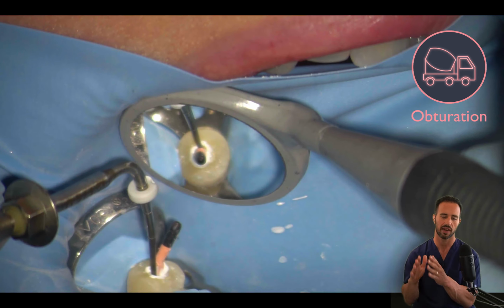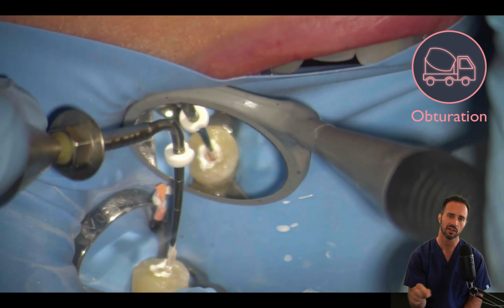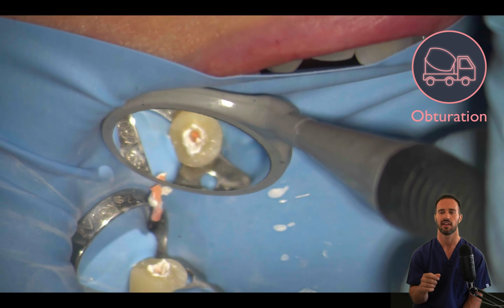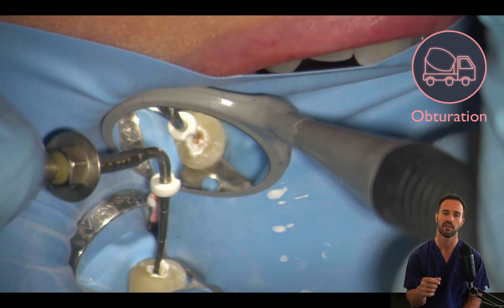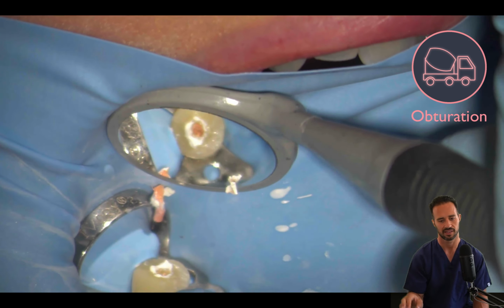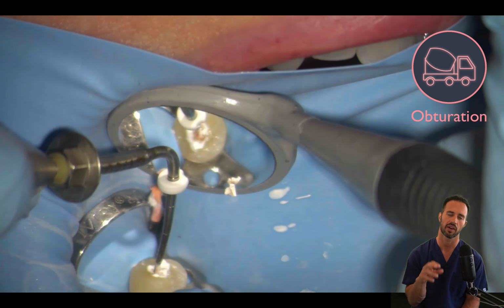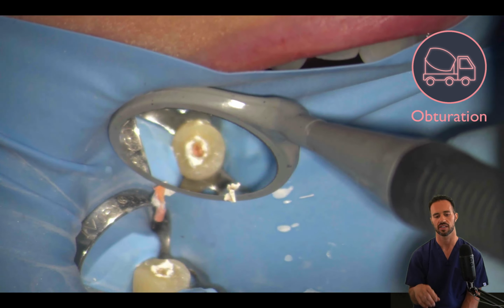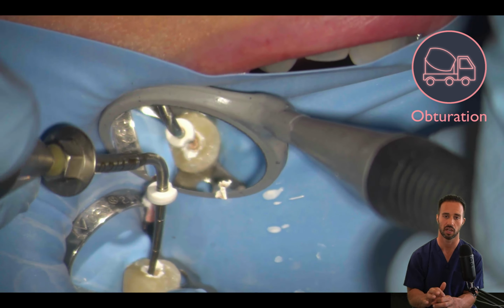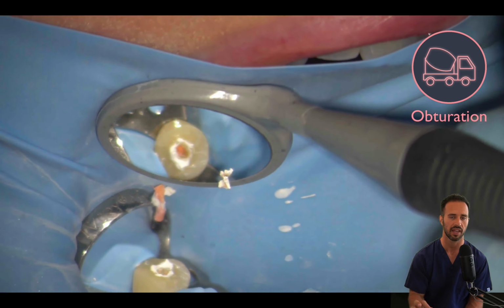And so now we're using our System B 08 tip to sear off the gutta percha right at the orifice. Okay, again, this is a form of obturation known as hydraulic condensation, and we're going to go ahead and sever that off at the orifice, and then start our compaction of gutta percha with our size 1 Buchanan hand plugger, and we're going to use the larger side of that Buchanan hand plugger. That's the red hand plugger.